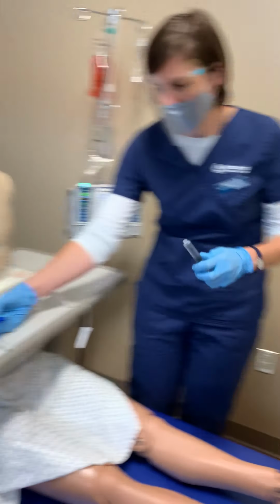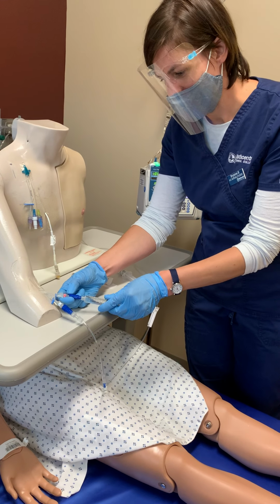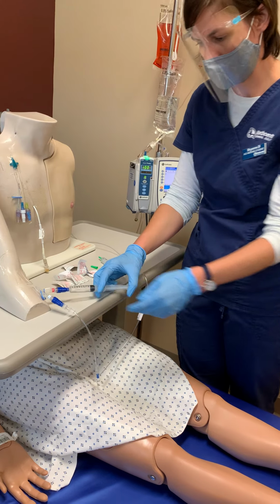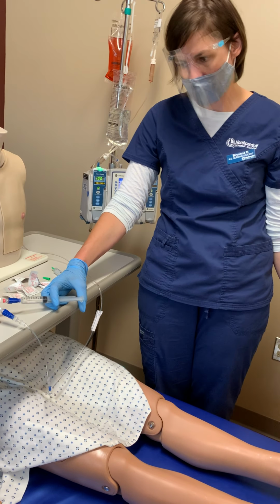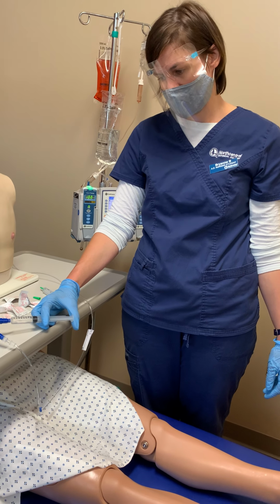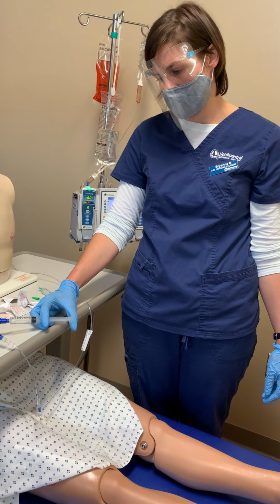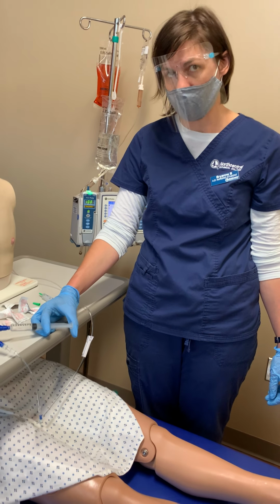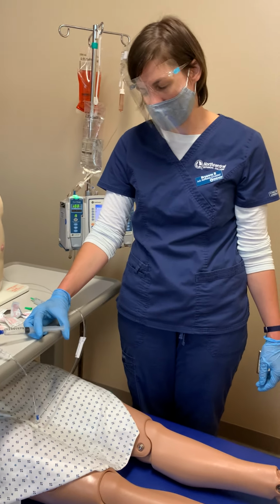Whoop. And on there. Now again, I'm gonna do at least 5 ml at the same rate as I did the morphine, which is at 4 to 5 minutes. So very slowly, because I don't want to bolus that last bit of morphine for Frances.